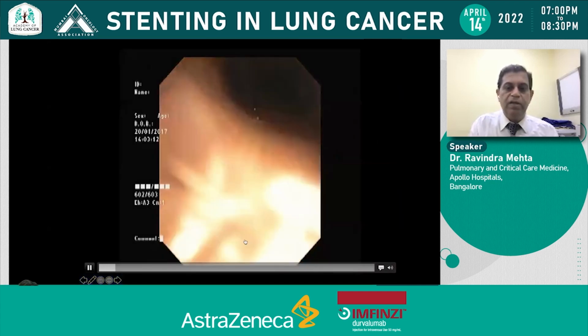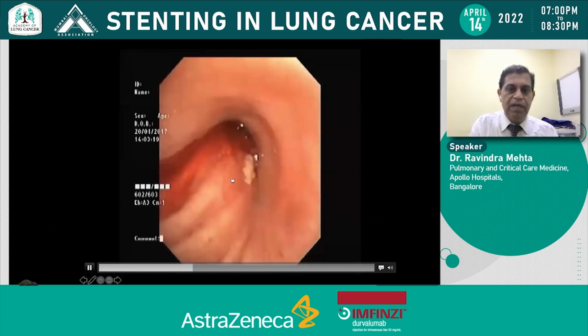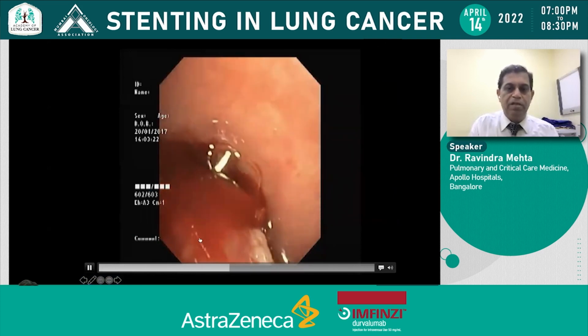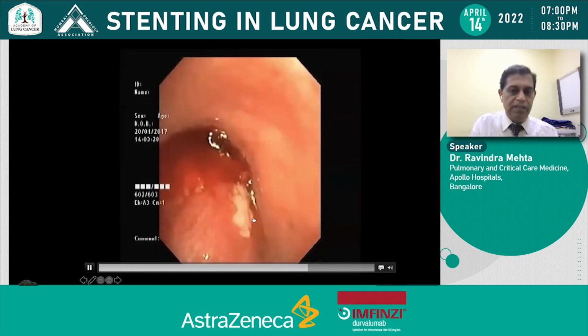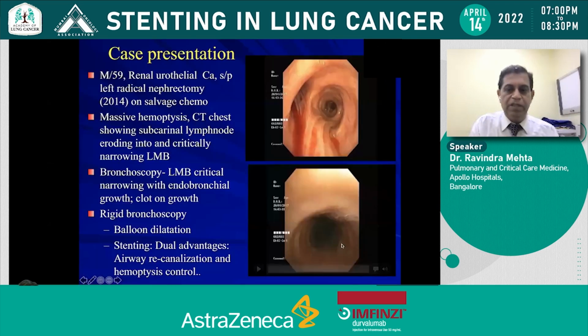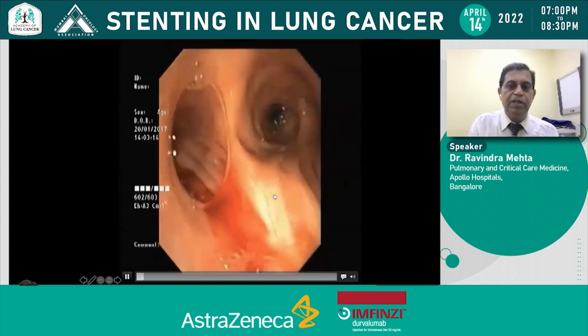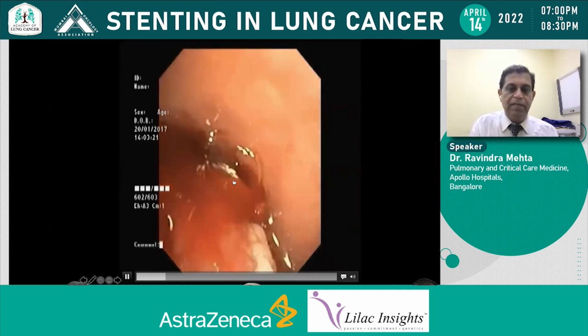Well, we started over here. You can see the check bronchoscopy going in under suitable sedation. Left main bronchus blocked. Clearly, the tumor is the cause of this bleed over here. And so, in this situation, something needs to be done. A therapeutic modality approach is planned. We go in there with a rigid bronchoscope. We have to both recanalize the airway as well as fix the hemoptysis.